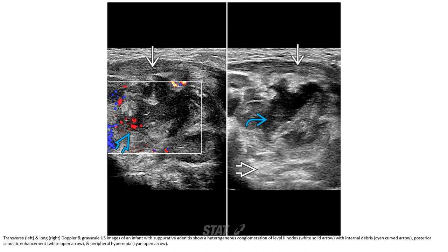This is the ultrasound image of a patient with suppurative adenitis, showing a heterogeneous large conglomeration of a level 2 node with internal debris, posterior acoustic enhancement, and peripheral hyperemia.